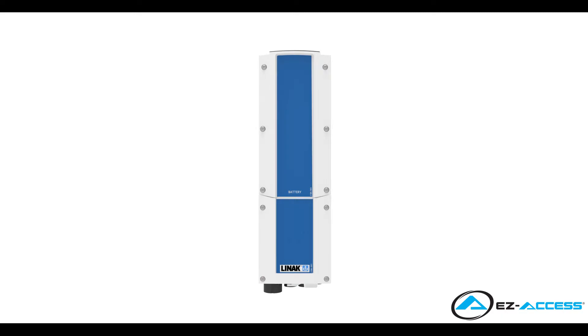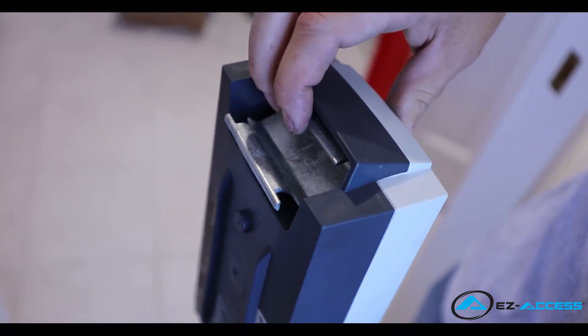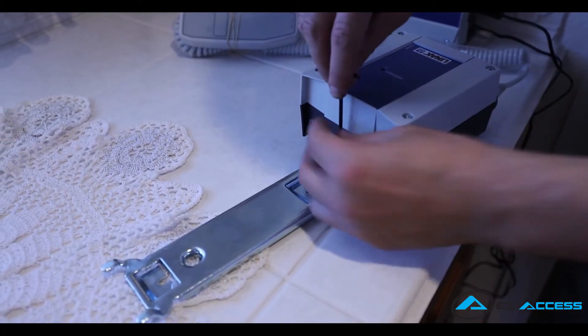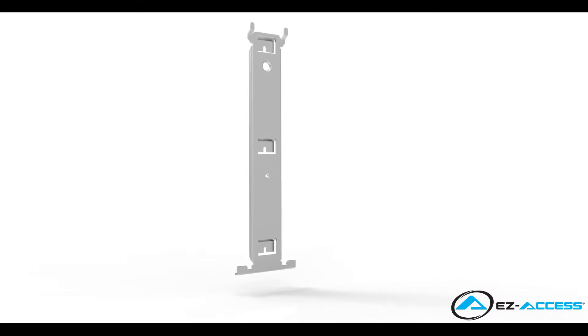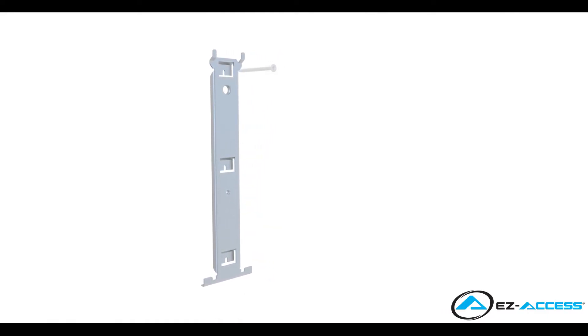Now prepare to mount the battery and control box in the selected ideal location by securing the mounting bracket to the wall. First, remove the battery from the mounting bracket by squeezing the spring handle inward and pulling upward on the battery until it slides up and disengages from the mounting bracket. Set the battery aside, then release the control box from the mounting bracket by removing the single screw using a 3mm hex key. Set the control box and screw aside and prepare to install the mounting bracket to a wall or other suitable structure within 3 feet of the actuator. Place the mounting bracket against the wall and attach with appropriate hardware using all 3 hole locations.